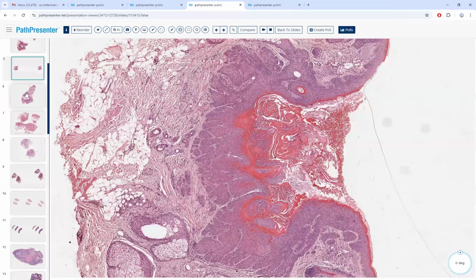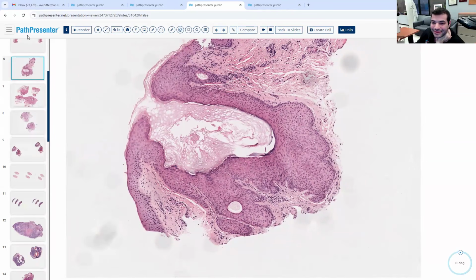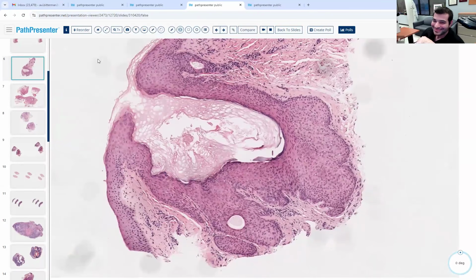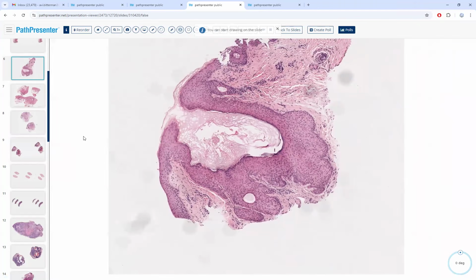Pilar sheath acanthoma. What about this one? Or dilated pore, that's also pilar sheath. Well, by the way, when I say what about this one, it doesn't mean you got the previous one right. So which one has more bulbosity, this one or the previous one? I think this one looks more like pilar sheath acanthoma. Yeah, and why?